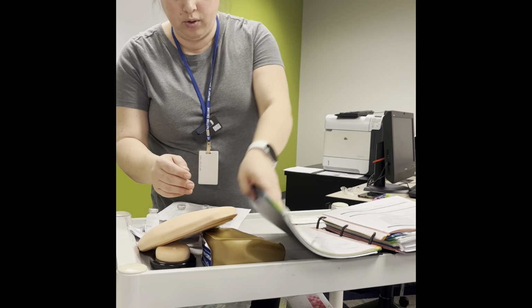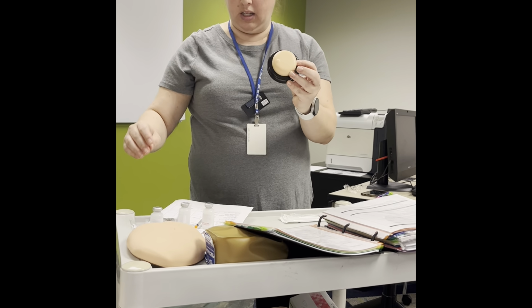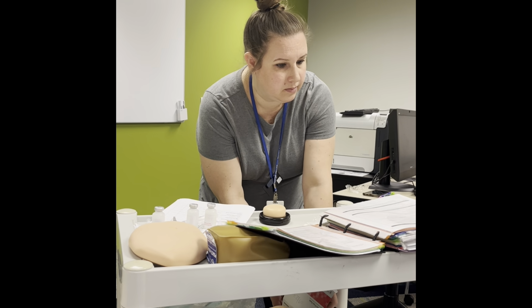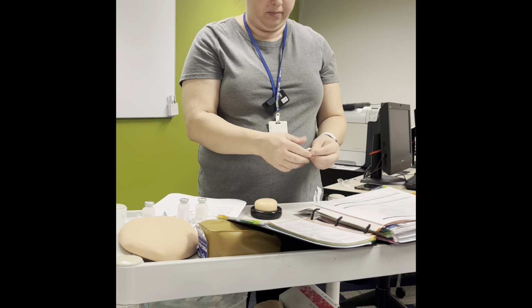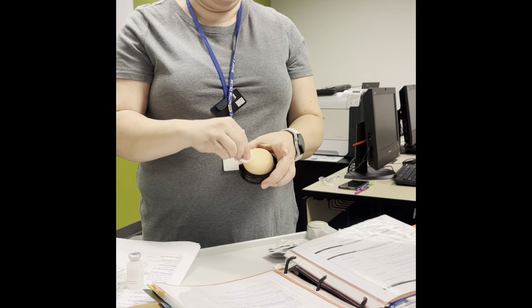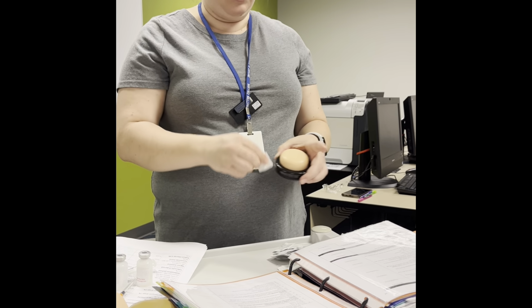So now we're going to clean off the pad. So the pad we're going to use is a little circle. So we're going to take our alcohol wipe, and we're gonna clean about 2 inches in a circular motion. So just the top of this. And as you can see, they're sticky, so it's kind of rubbing. The next step, I want you to tell me, number 7, I want you to tell me.